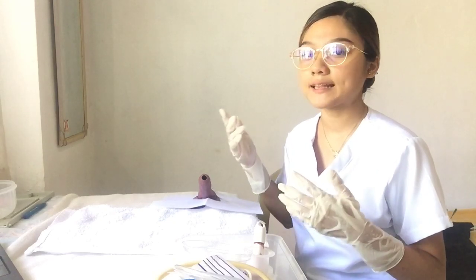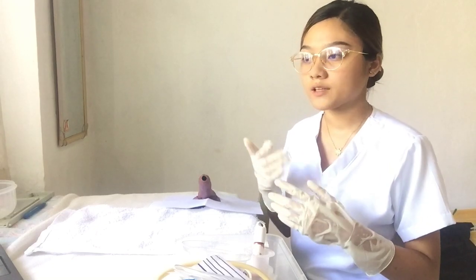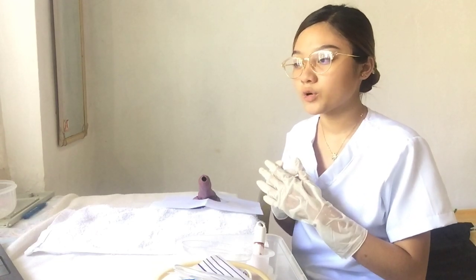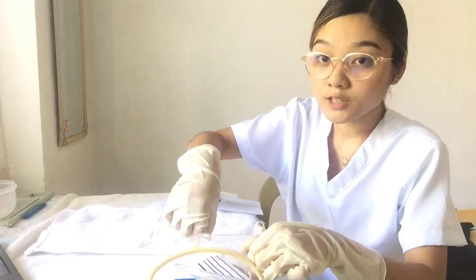With the non-dominant hand, hold the penis at a 90-degree angle to the body. If the patient is uncircumcised, pull back the foreskin to visualize the urethral meatus. Then use the sterile hand to pick up the cleansing solution — either antimicrobial swabs or soaked cotton balls using sterile forceps — and clean the urinary meatus with one stroke using a circular motion.